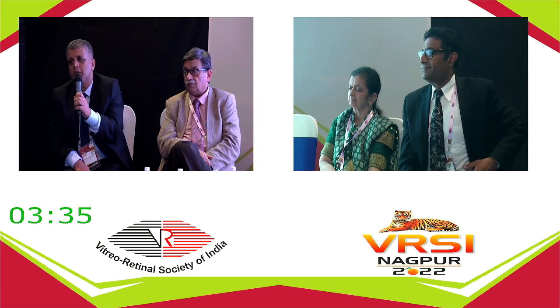Same with me, laser with close follow-up. But in some cases, what I have done, if I find that the edges of the tear are really edematous and appear necrotic, I add oral steroid, and this helps in early healing and the laser taking up better.